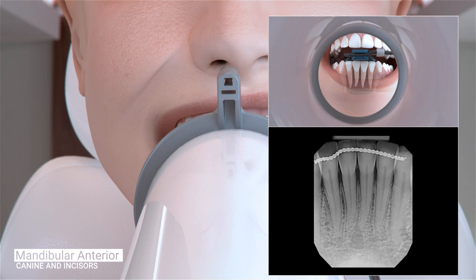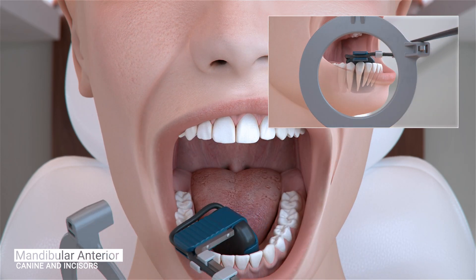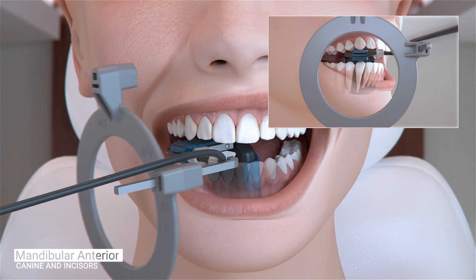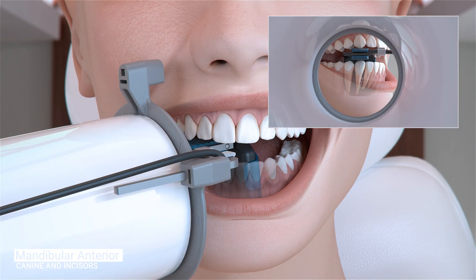Ask the patient to open and reposition the sensor to the right canine. Position the sensor so the canine is centered on the sensor and the sensor is parallel to the long axis of the tooth as much as possible. The tongue should be mildly displaced so the sensor can be inserted into the floor of the mouth and far enough away from the teeth as not to impinge on the mandibular curve. Ask the patient to gently close and slide the aiming ring as close to the patient's chin as possible. The cone of the x-ray emitter must be placed flush with the aiming ring and then trigger the exposure.